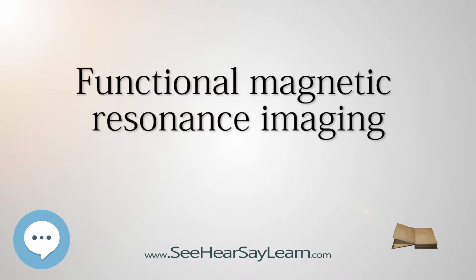The central thrust behind fMRI was to extend MRI to capture functional changes in the brain caused by neuronal activity. Differences in magnetic properties between arterial, oxygen-rich, and venous, oxygen-poor, blood provided this link. Since the 1890s it has been known that changes in blood flow and blood oxygenation in the brain, collectively known as hemodynamics, are closely linked to neural activity.